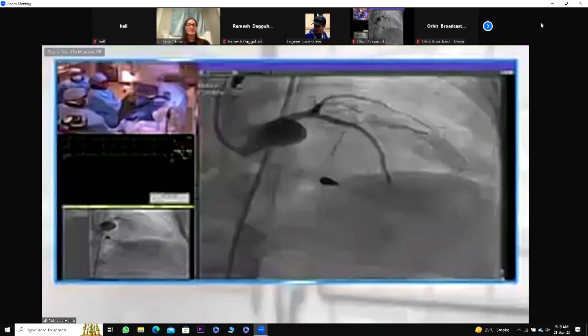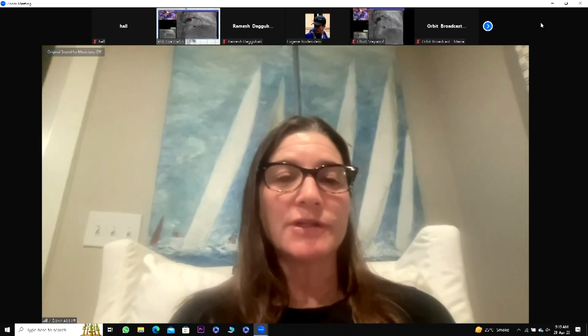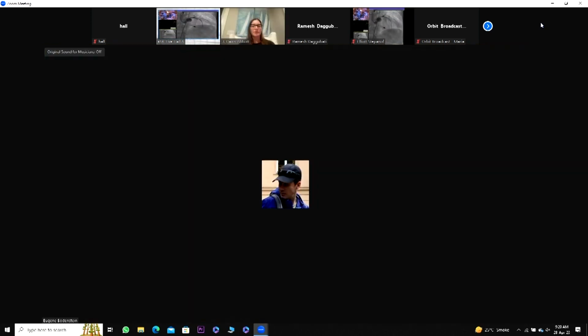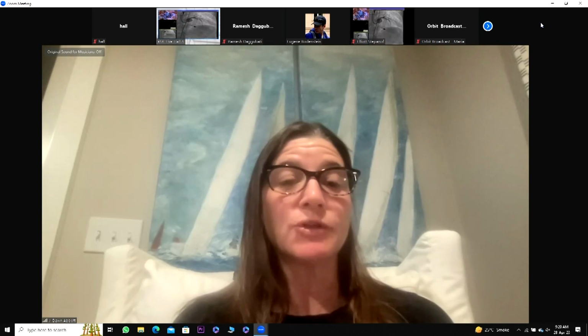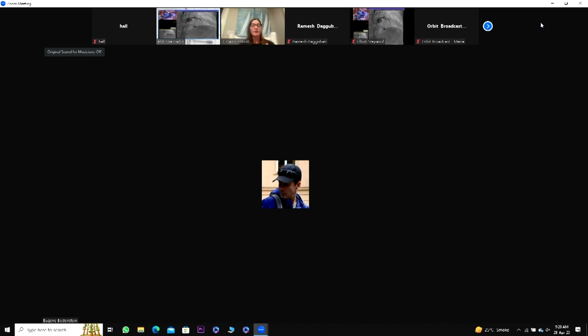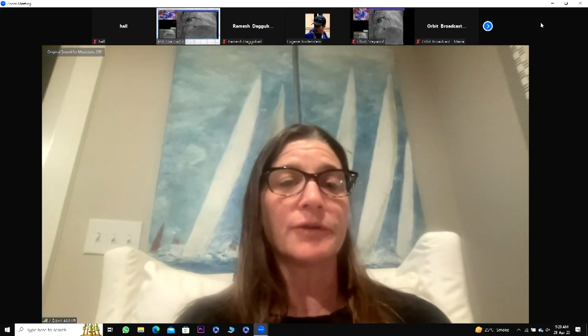Dr. Abbott and Dr. Ramesh? Yeah, I think for true complex bifurcation disease, according to definition criteria or similar other simplified criteria, I would go for DK crush, but if the angle is more right angle, could be very small, like nano crush, more like a T. I don't favor the culotte as much.